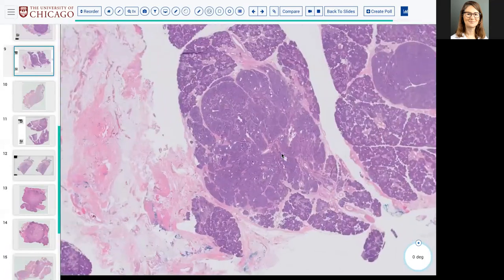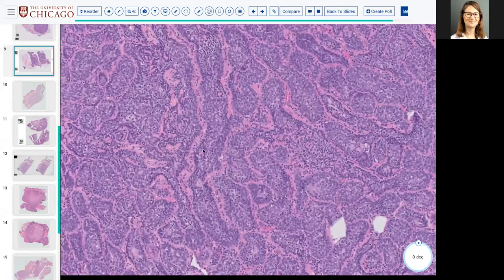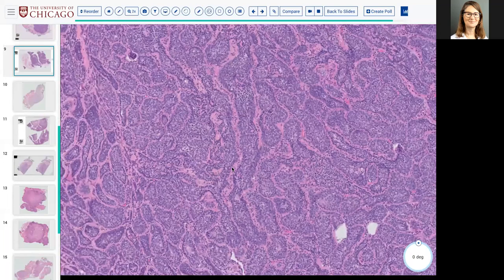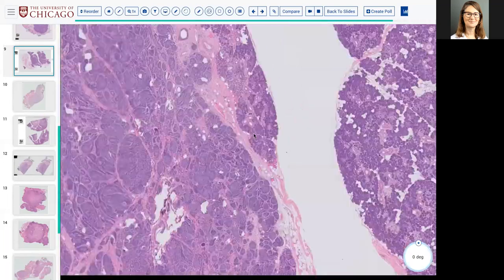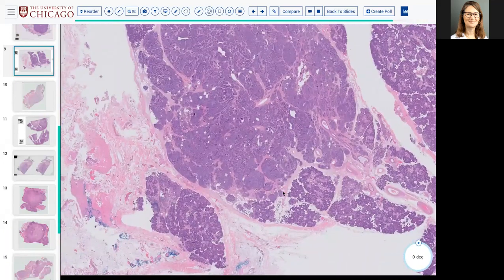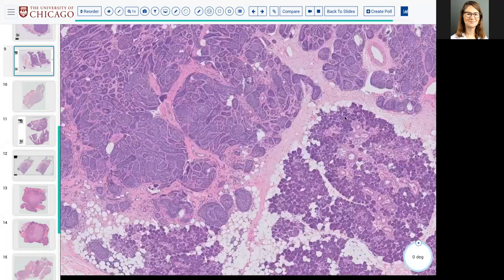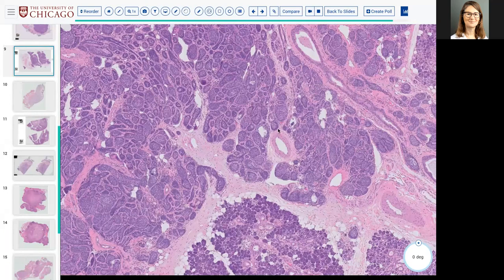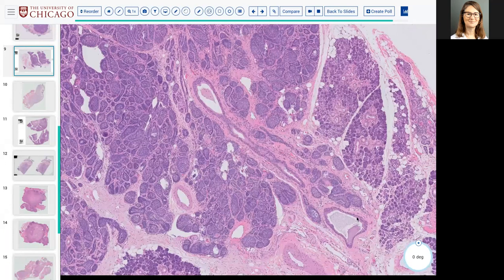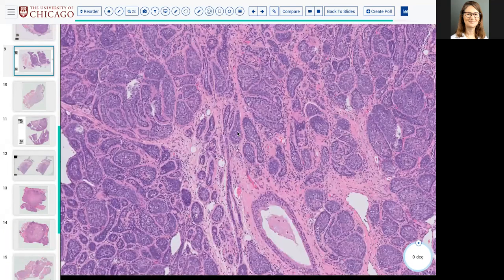So then I think you can maybe see where I'm getting at with the tumor right after it. Oh, very similar kind of tubulotrabecular architecture with hyalinized globules in it. Carcinoma, exactly. But if you look carefully in the other field, these lobules and nests percolate and infiltrate in between your other structures. They circumscribe your vessels. They run along either side of normal ducts. Exactly. So this is an invasive basal cell neoplasm. So this is basal cell adenocarcinoma.